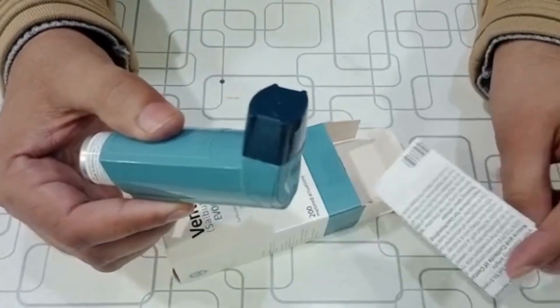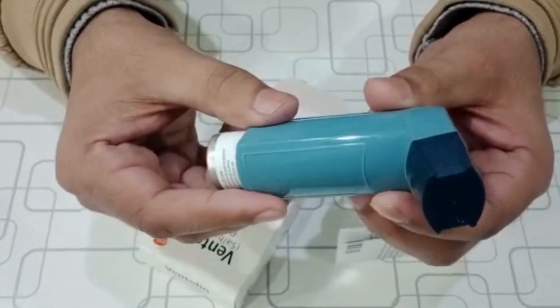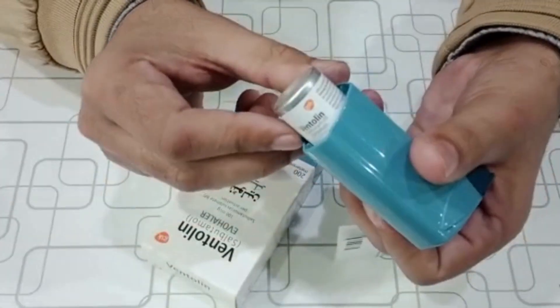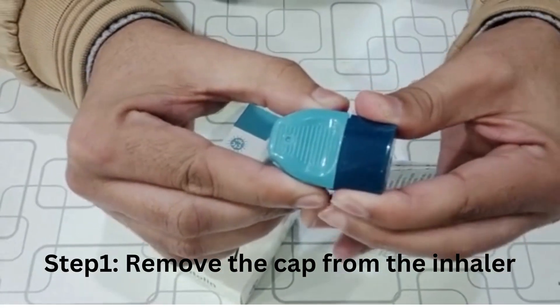For babies and children under 4 years of age, a spacer device is recommended. Now we will show you how to use Ventolin Evohaler. In step 1, remove the plastic cap from the inhaler.